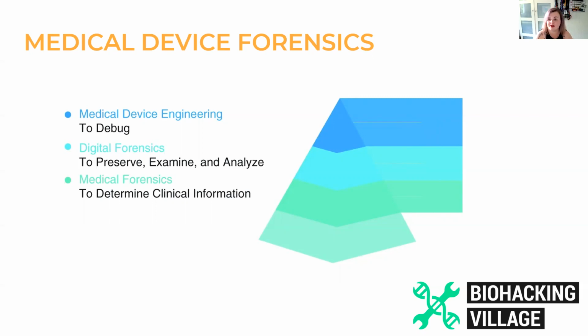Now, if I know how the device works and what underlying file systems it has, how the data is organized, I can anticipate where I will find my forensic evidence. Now, I also look at the clinical data. Can I visualize the clinical data as the physician or the doctor would see it? How does that correlate with the timeline that I had? How does it correlate with the functioning of the device? So kind of bringing it all together to have that whole holistic view of what exactly took place on the device.